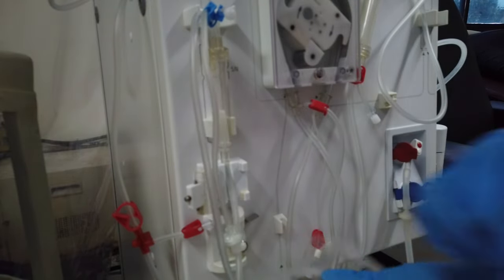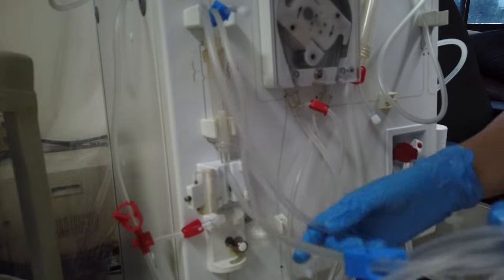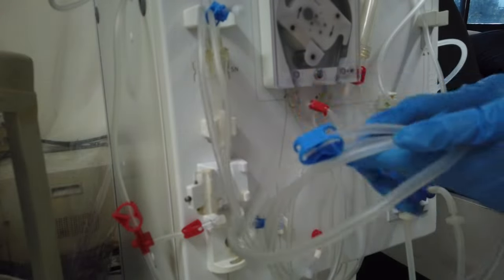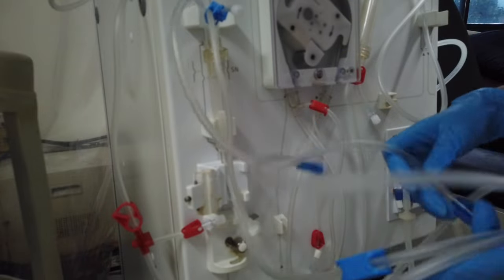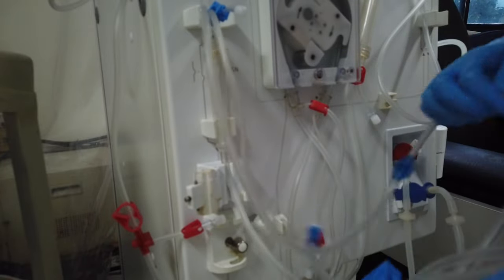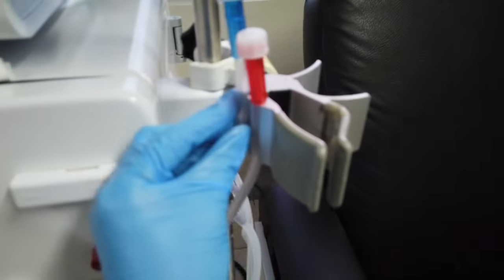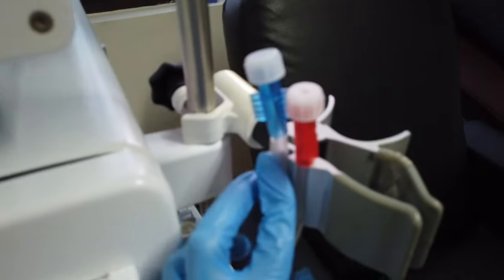Remove the paper cord tie, find the dialyzer end, carefully untangle it, and place it onto the dialyzer clamp or holder.